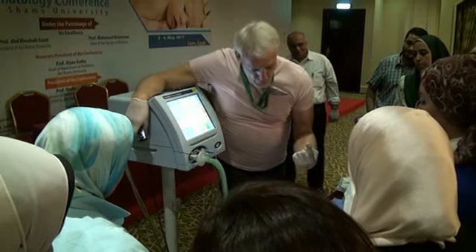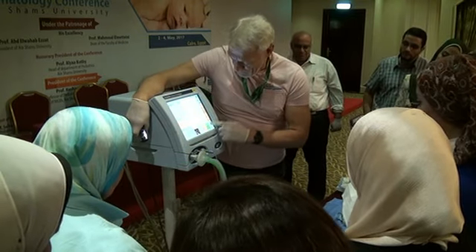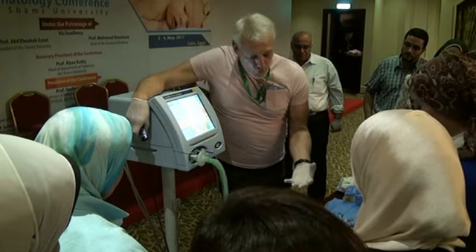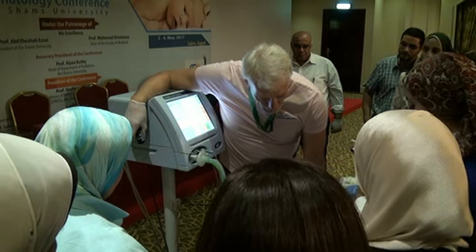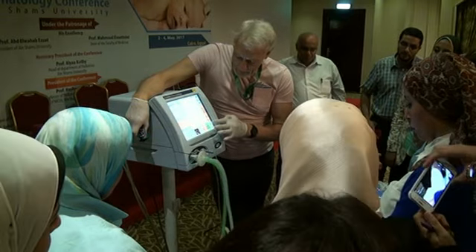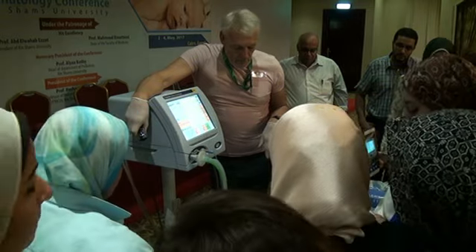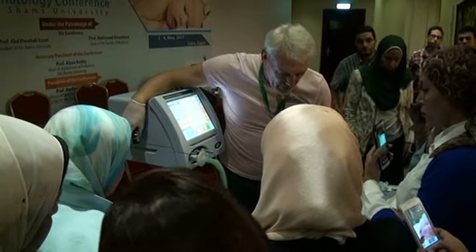And I hope you will see that as we go up, we will begin to recruit this lung better. We thought it wasn't badly recruited, it de-recruited a little. But as we go up on the pressure, and I'm going fairly quickly for demonstration purposes, we will begin to inflate these lungs better and better.